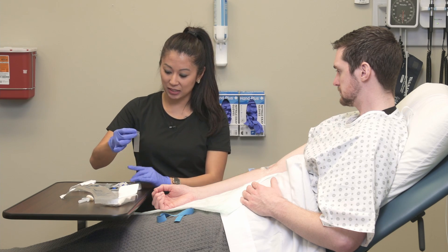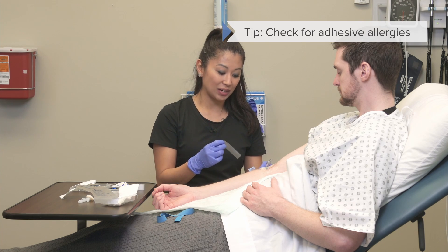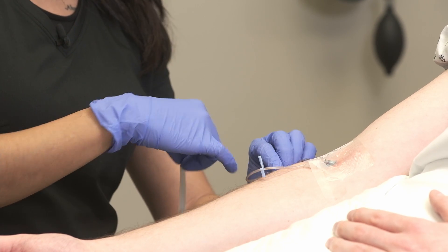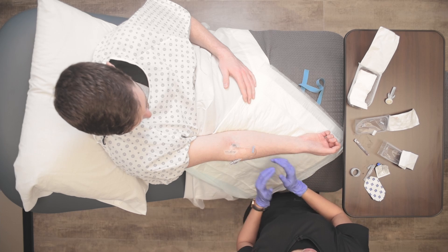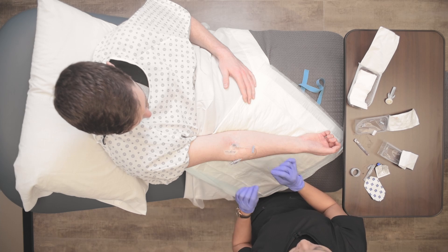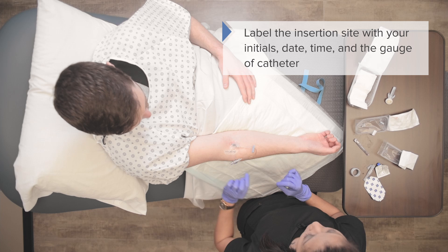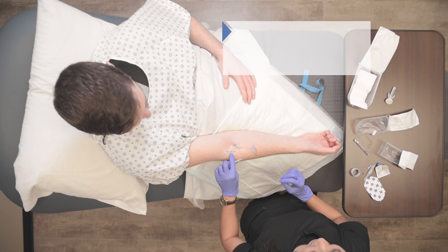One more thing to consider when inserting an IV: some patients are allergic to adhesive, so if that's the case there are alternatives you can use. I'm going to make a nice little loop and secure the extension tubing down so it's not dragging all over the place when the patient moves their arm. Also, don't forget that every transparent dressing comes with a little label reminding you to put your initials, the date, and the gauge of the catheter.